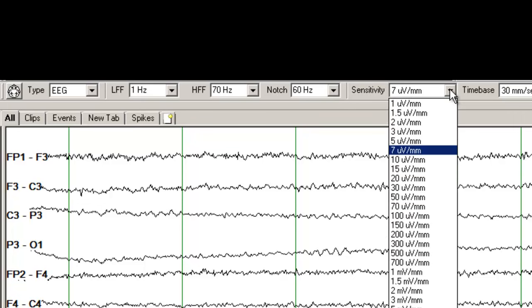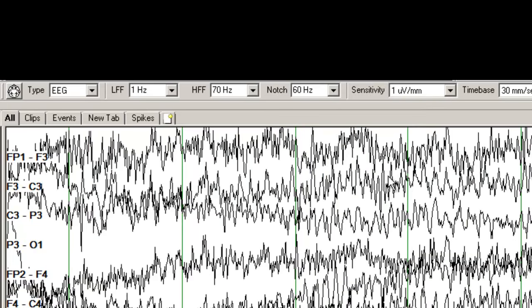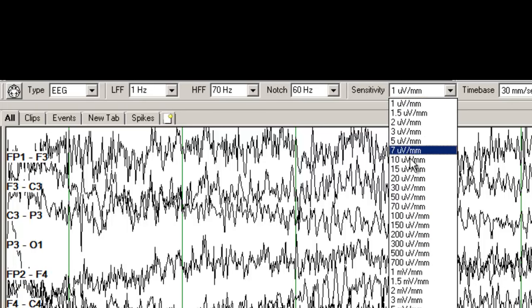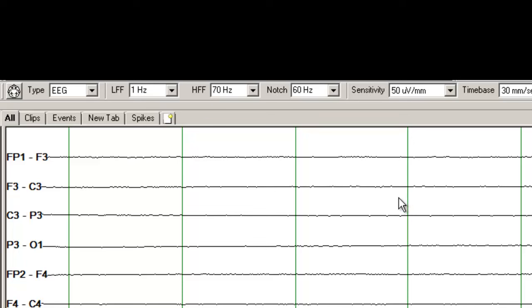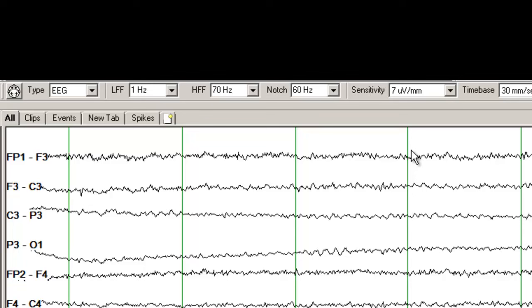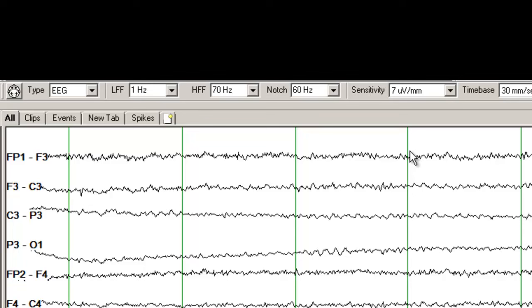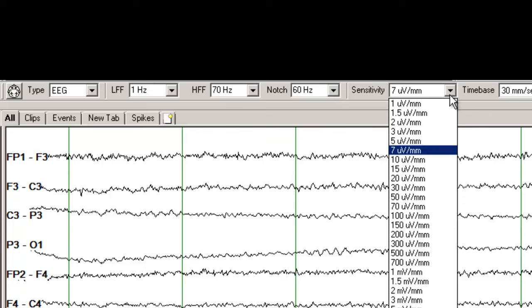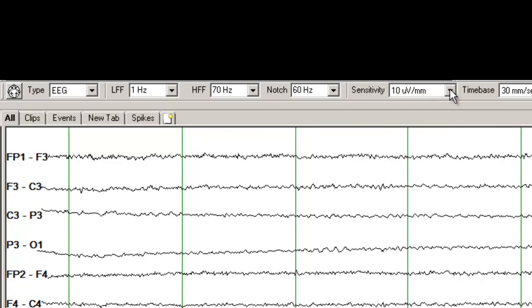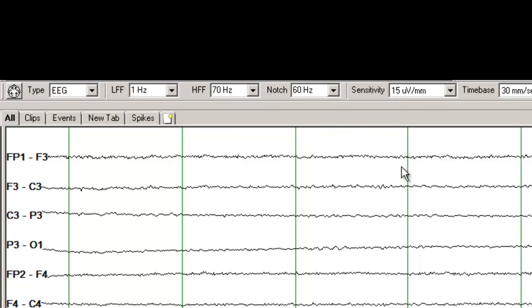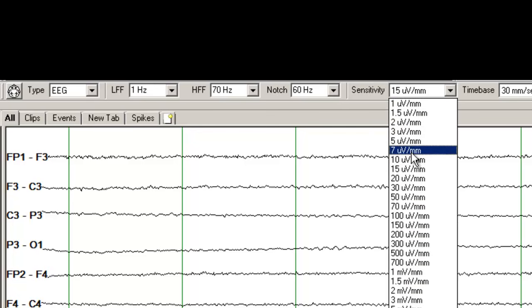Sensitivity basically refers to the gain of the EEG recording. If I set the gain at 1 µV per mm, you will not be able to read anything because everything is overlapping. If I set it up at 50 µV per mm, you don't see anything because all the amplitudes appear suppressed. A good sensitivity in adult patients is 7 µV per mm. If there is overlap between channels, you can adjust the gain — maybe go to 10 or 15 µV per mm in younger individuals. So I will set it back to 7 µV per mm.